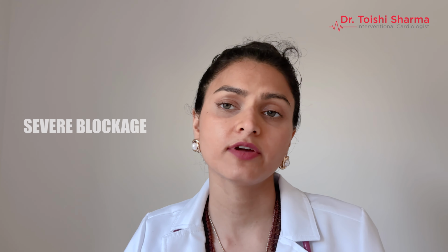And the decision depends on the symptoms, the presentation, and the doctor may do special tests like FFR or DFR, which measure the blood flow and help us to decide whether this moderate blockage should be treated like a mild blockage just with medications, or should this moderate blockage be treated like a severe blockage with stents or surgery. And the third option may be a more than 70% blockage.